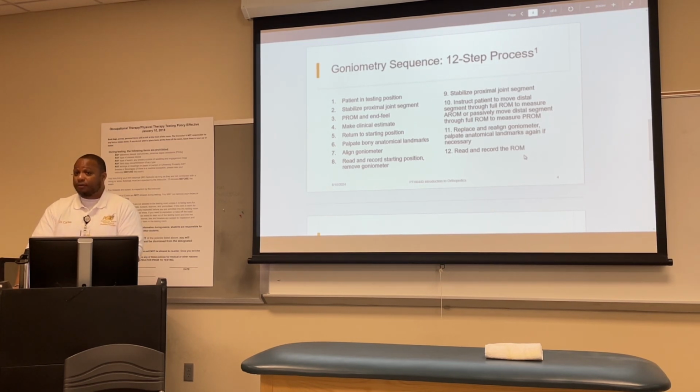I would specifically say passive range of motion if I want you to do passive range of motion. If it just says quantify the range of motion, what are you quantifying? Active range of motion. I'm telling you right now, the reason I'm going through this presentation is that I will let you know if we want you to quantify passive range of motion.